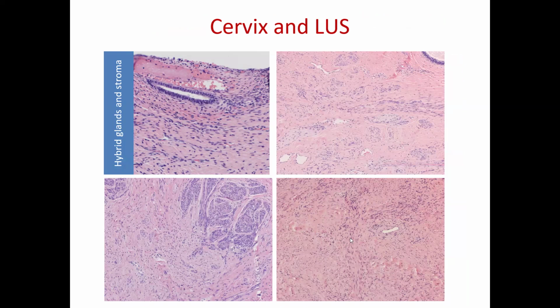But the stroma of the cervix, as you can see here, it's not really robust in terms of musculature. If anything, it is not muscular. It is so pink because it's full of elastic fibers, and it is rich in nerve fibers. So I want you to develop this sense. You can look at this stroma and say, yeah, I think this is the stroma of the cervix. Maybe lower uterine segment down here. But this is not myometrium.